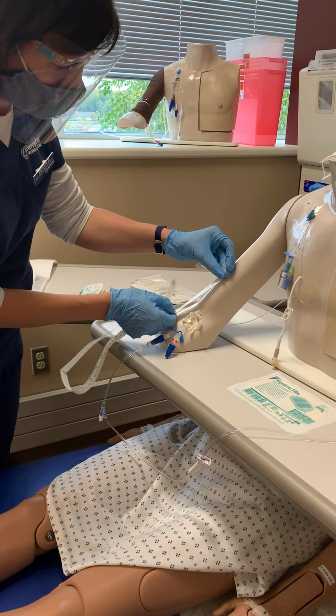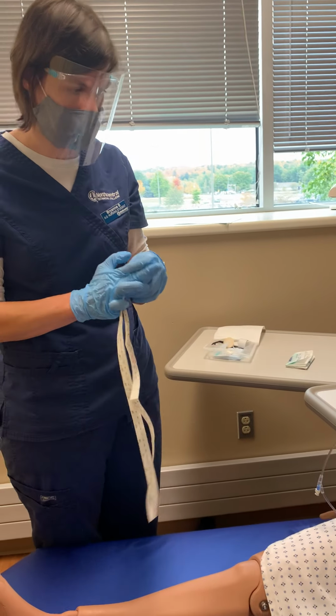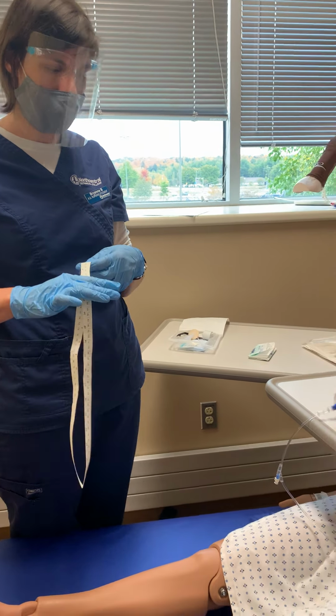My other thing, I just stopped here because I want to measure from the hub to insertion and compare that as well against my chart. And I can touch it here because it is still covered by the bandaging. And it is the same as what I saw on my chart for the length of catheter exposed from hub to insertion. So I can be done with my ruler. I would probably wash hands again at this point, and put on another pair of gloves, just because I was messing around with my tape measure.